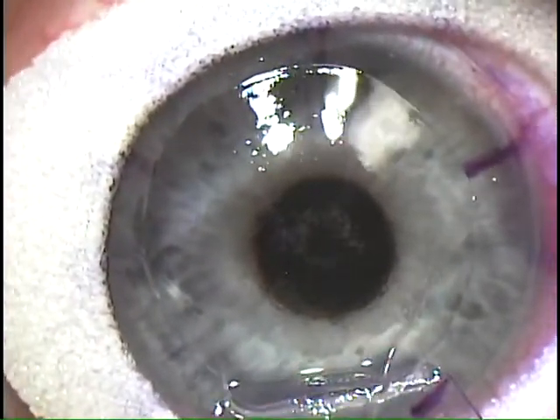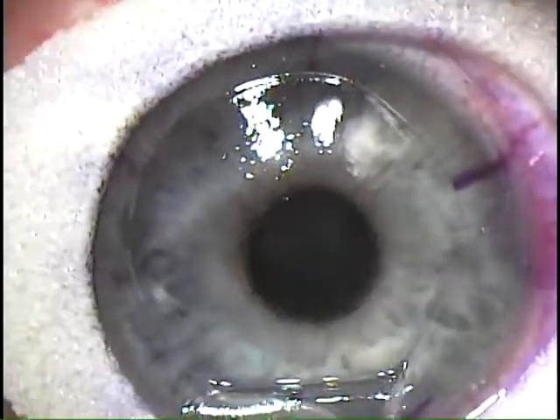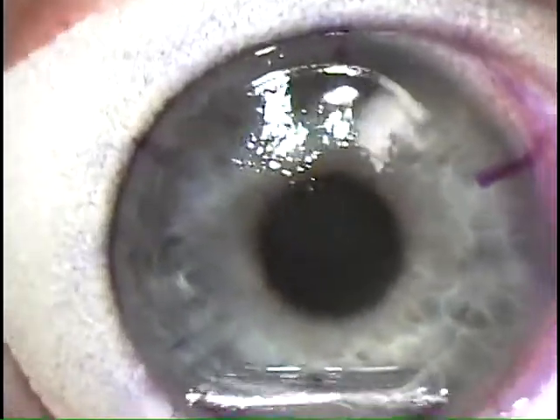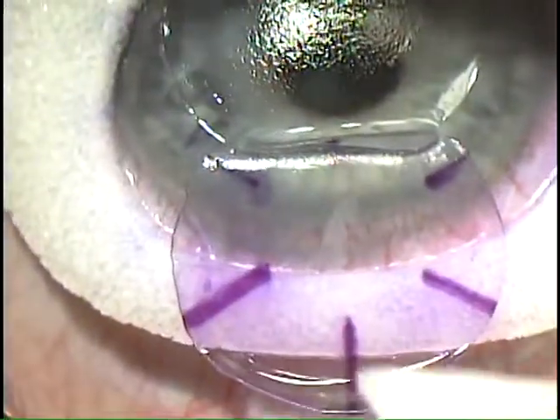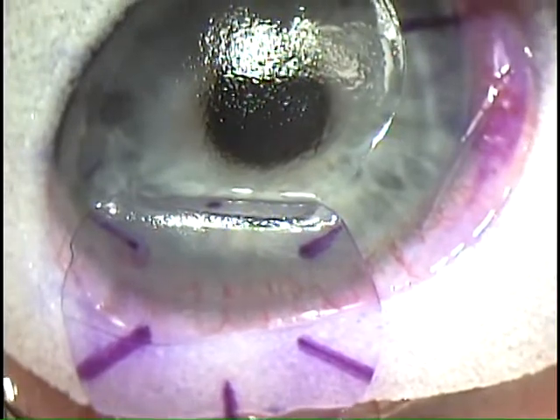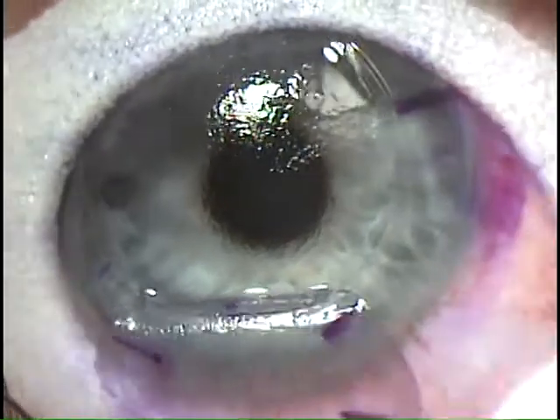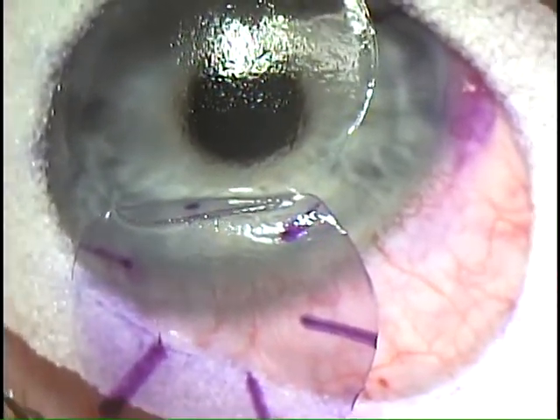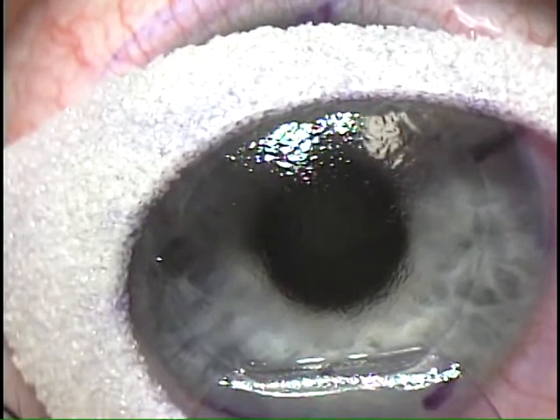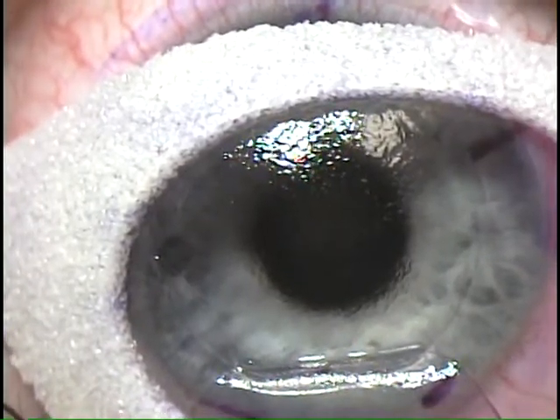I'm just going to wax out here for a second. I'm just going to take this guy. Look down. Now just look straight. All right. Okay. Thank you.